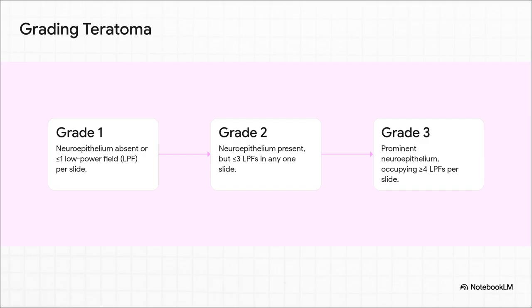This simple 3-step system is like a universal translator. It turns what you're seeing under the microscope into a grade that everyone on the team understands and that directly guides patient management. It's pretty brilliant.